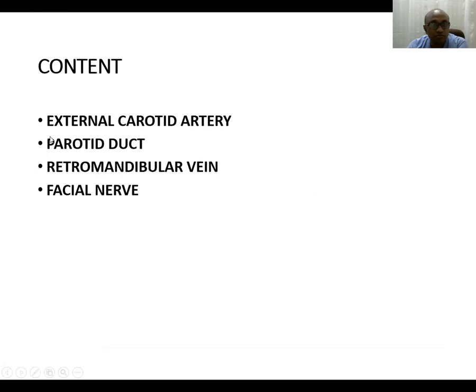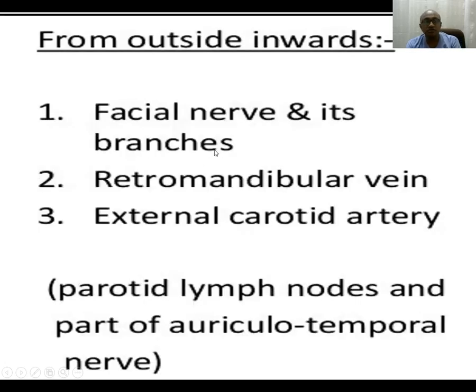In terms of content, there are four structures: mostly the external carotid artery, parotid duct, retromandibular vein, and facial nerve. Apart from that, sometimes enlarged parotid lymph nodes are found. If you see the structures from lateral to medially, you will find the facial nerve and its branches, retromandibular vein, external carotid artery, and part of the auriculotemporal nerve and parotid lymph nodes as the usual contents.